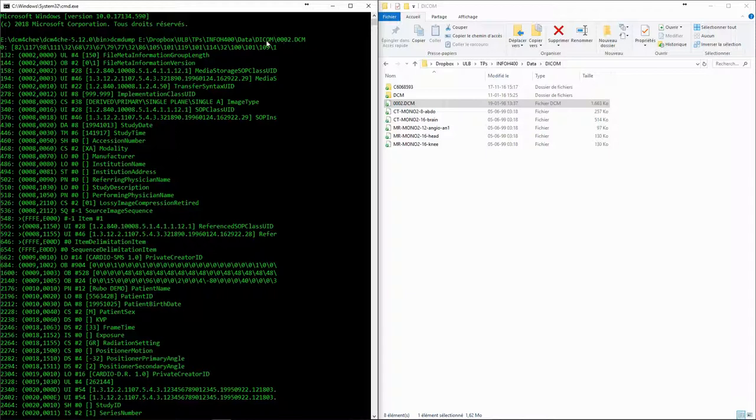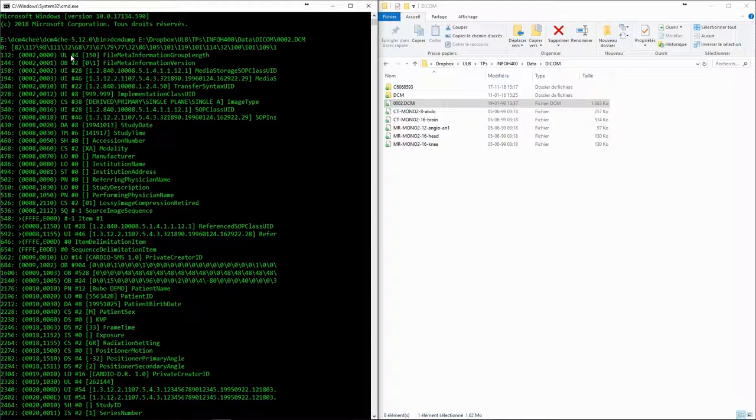The first number is the position within the file. First we have at the zero position the preamble, which is ignored. Next, you can see the information that we already saw in the hexadecimal viewer. This also tells us the name of the tag, so that we don't have to look up in the documentation each time.